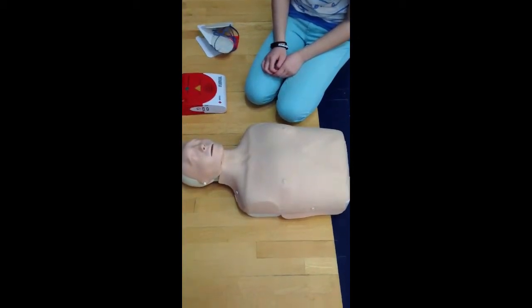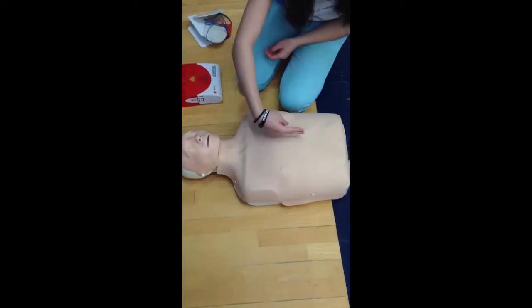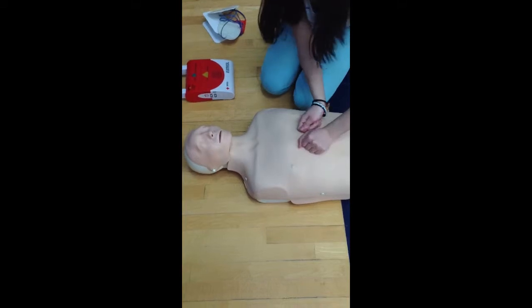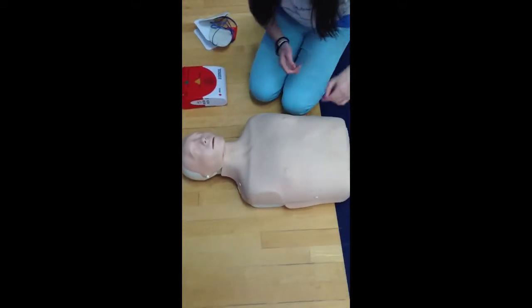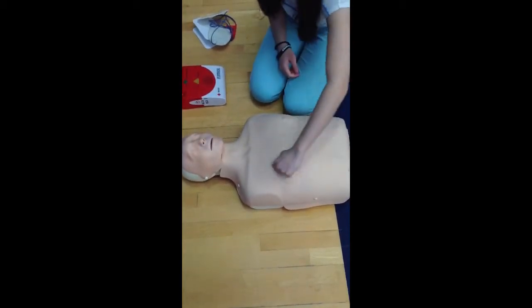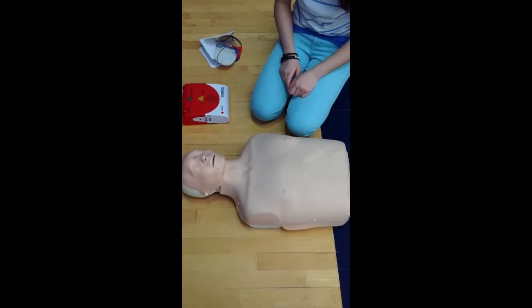Before you can even put the AED on, you need to remove all the clothing from the person's chest. If the clothing is hard to get off, you may need to use scissors, which each AED kit comes with. Or if a man has a particularly hairy chest, you may need to use a razor to shave off the hair, or you can use the AED pads to stick to the hair and rip it off. That way the area is clear to use the AED pads.